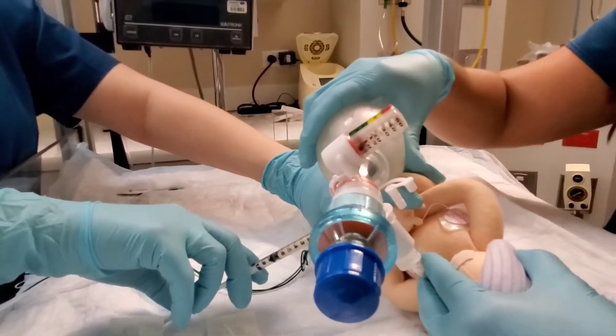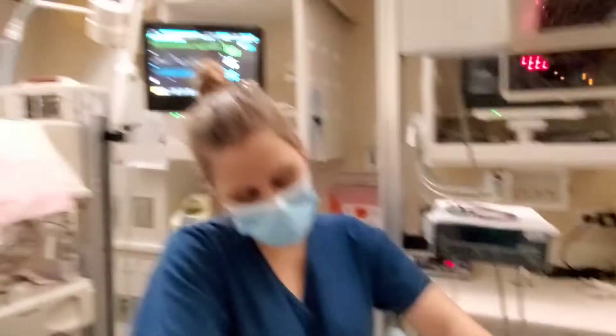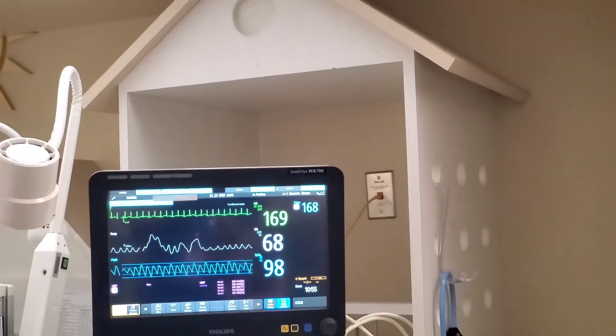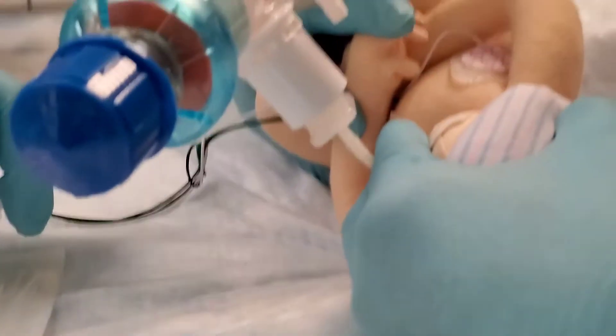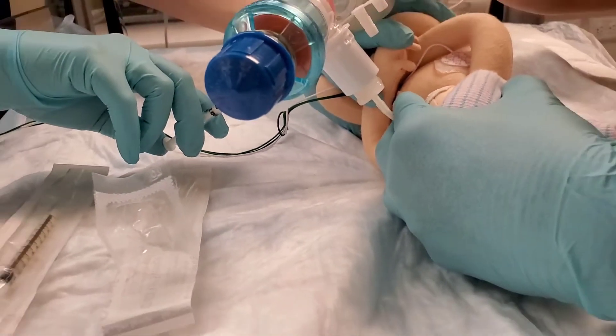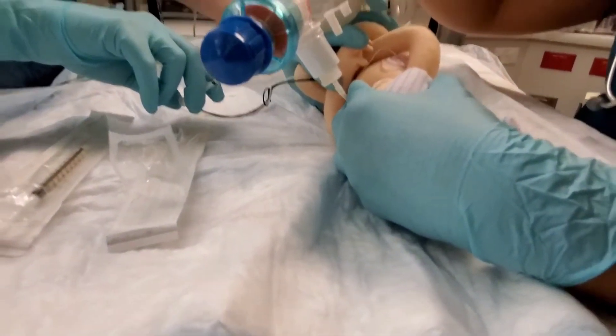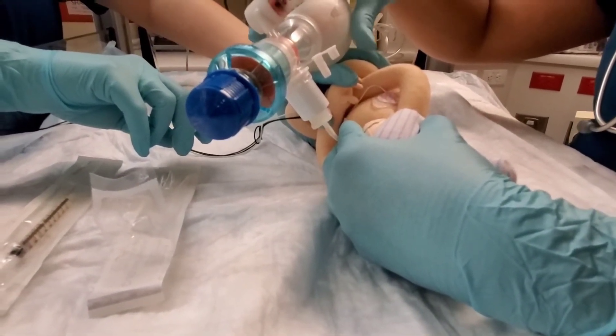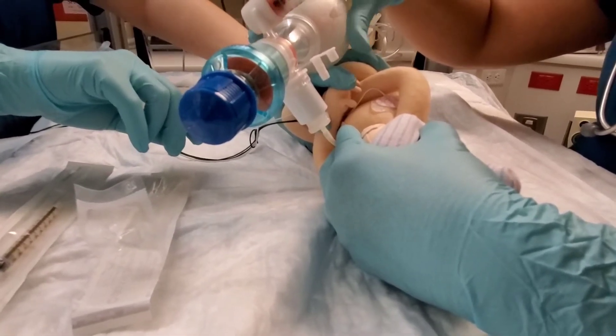We're monitoring the pressures. We're monitoring the sats and the heart rate, watching that and making sure the baby's doing well. Everything's looking really good. The baby's heart rate is good. Baby's saturation is good. Everything is going very well.